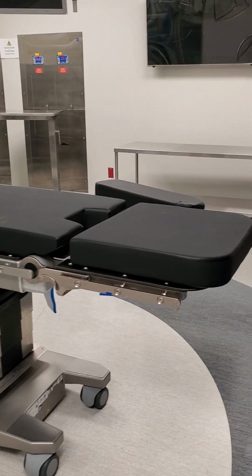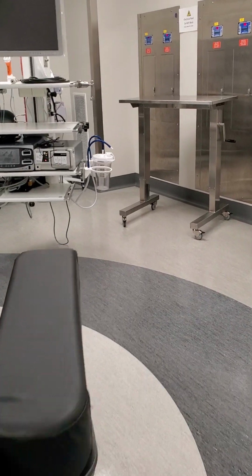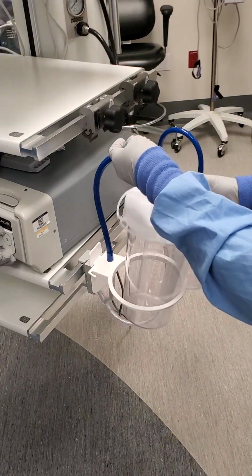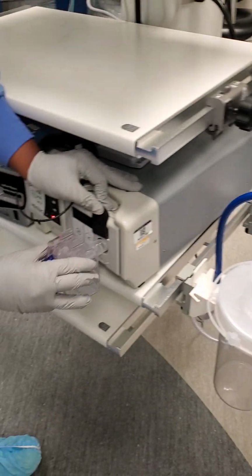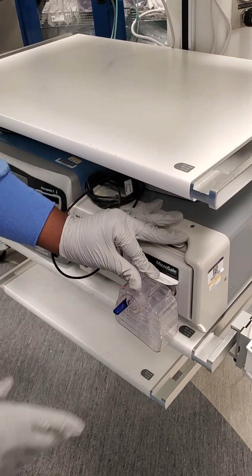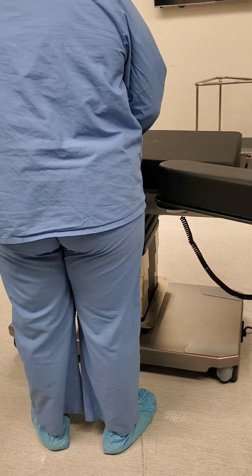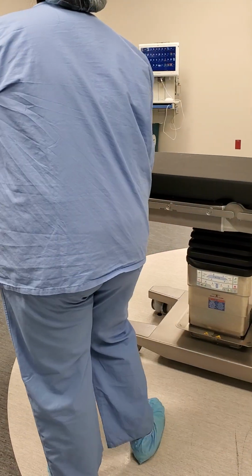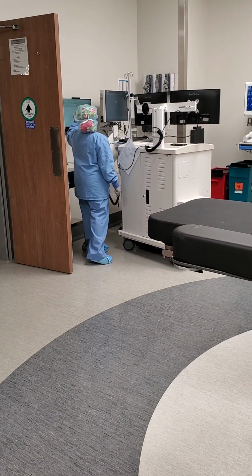At this point, we would make sure to replace any suction canisters that needed to be replaced, making sure that all of the valves have been closed except one, and that it's plugged up and ready to use. If the smoke evacuator needs to be replaced, just place it in the machine by pushing in. At this point, if we were going to reuse this room, we would make sure to put fresh sheets and trash bags out in the room. And then the last step is to go to Clinical Workflow Suite and make sure to tap that the room is officially cleaned.